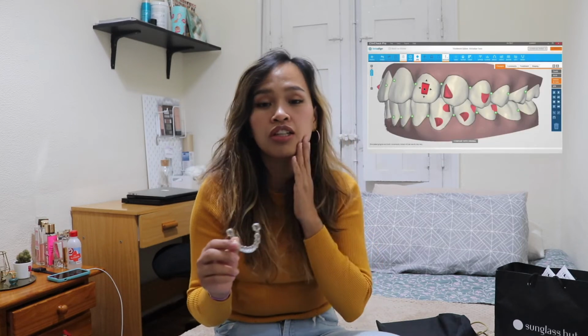I have 16 attachments. It means the dots that you put on your teeth, instead of the traditional braces where you put the wires, where the dentists do adjustments with the wire. In Invisalign, they're using attachments. You know what I mean? Because it's digital, even though you haven't started yet, you know what the end of the treatment looks like. You can already see how it's going to align your teeth.